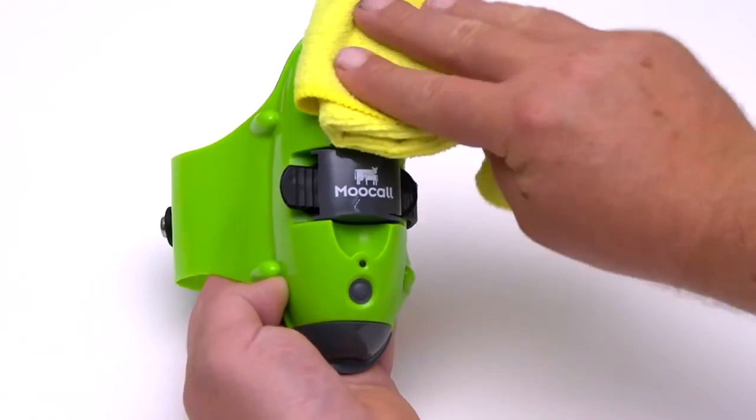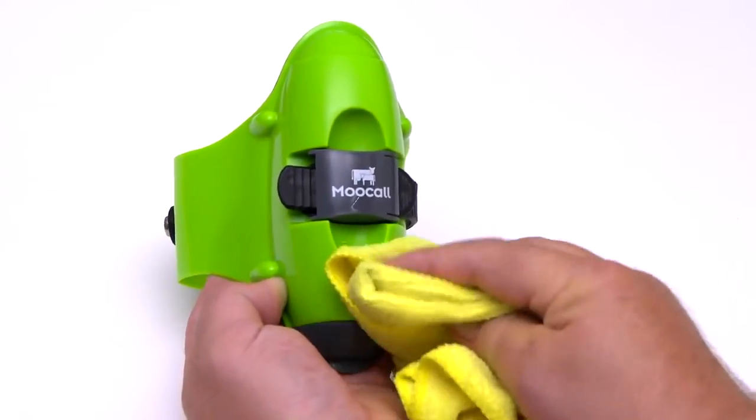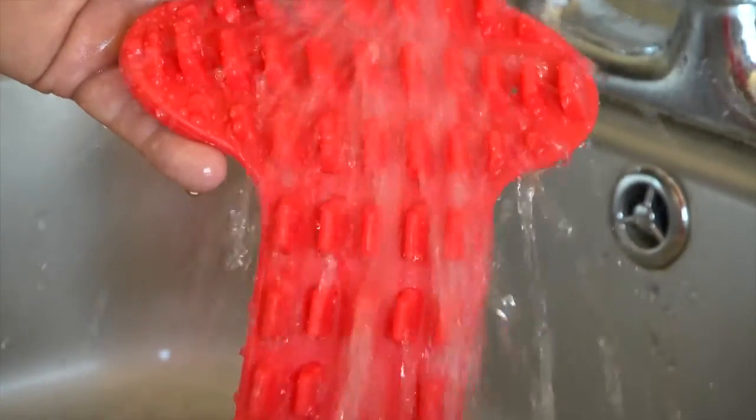After a calving event, clean the sensor with a damp cloth before fitting the sensor to a different animal. Remove and wash the red rubber lining.